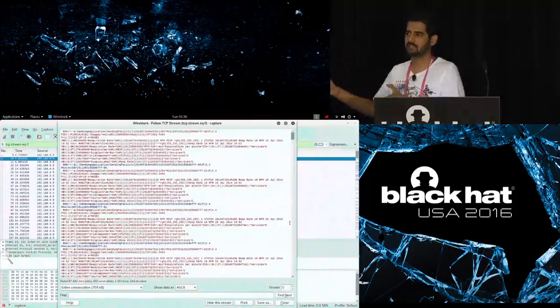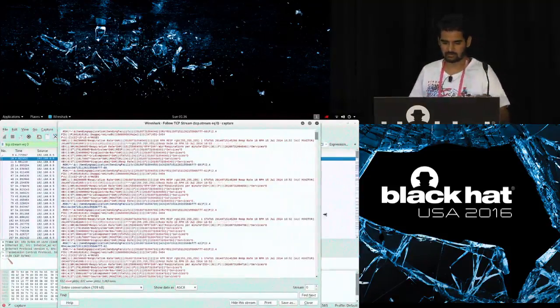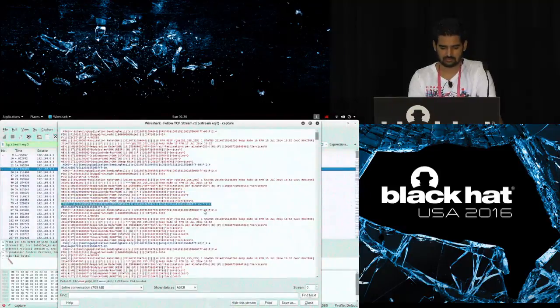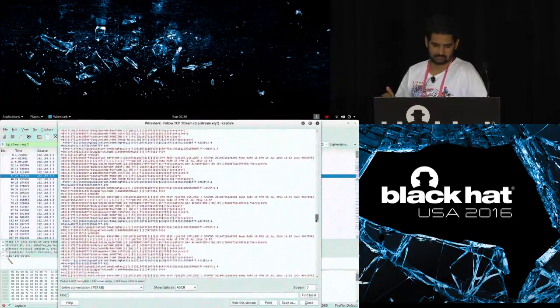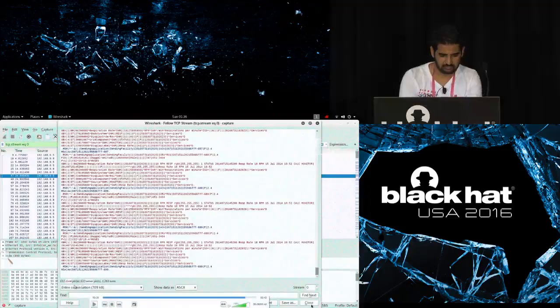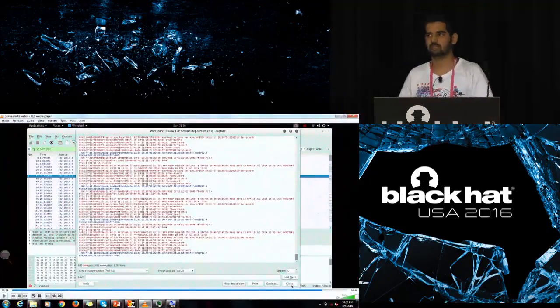And imagine handling this data in GBs. So you need to be very particular about what you're attacking. If you see this, these are all ORU messages with OBX segments. Right, so what I'll do is I'll scroll next, and the only thing that will change is the timestamp. All right, so these are about 632 packets. This was in about 5 minutes. In a hospital environment, this will be huge.